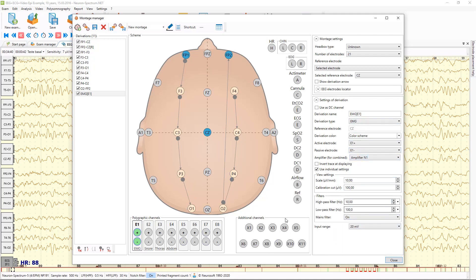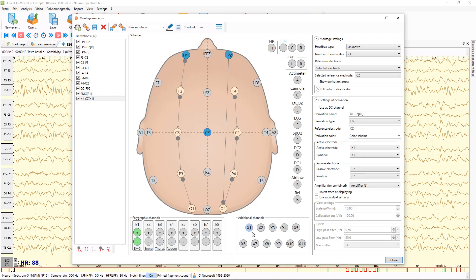Also you can use additional EEG channels. You can also use them as monopolar or bipolar derivations.